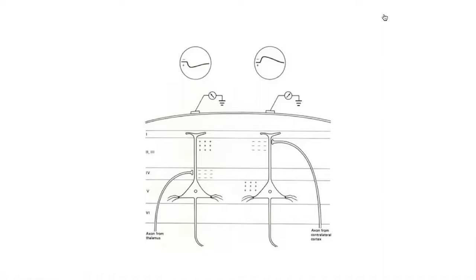It's the output, of course, for any electrophysiologic monitoring. The difference here is that with the EEG, the electrical fields are so small that we have to be looking at 2 locations and comparing in order to see a signal of meaning. We can't compare the location of one neuron or one field here to some neutral reference and see how it's changing, because there's so much noise in the environment. And this is a fundamental aspect of EEG, that we're always comparing 2 locations. Next slide, please.